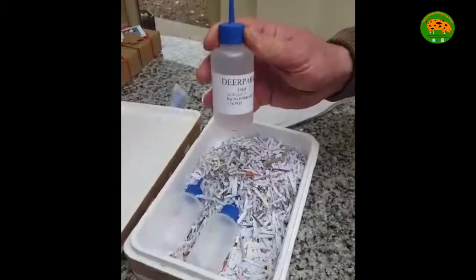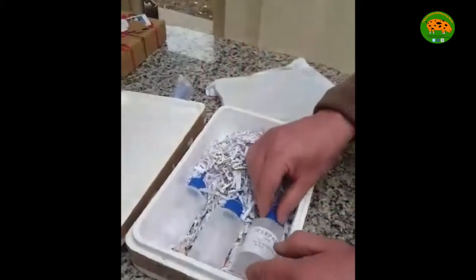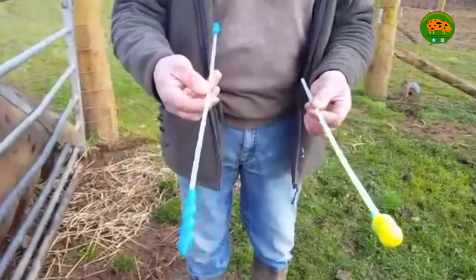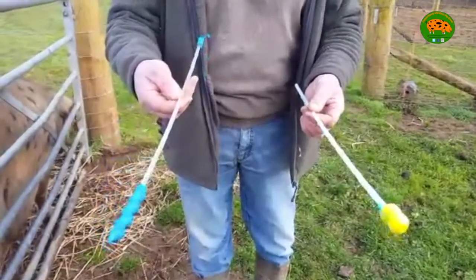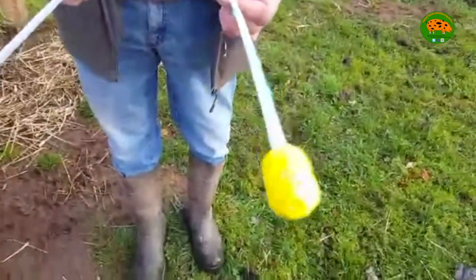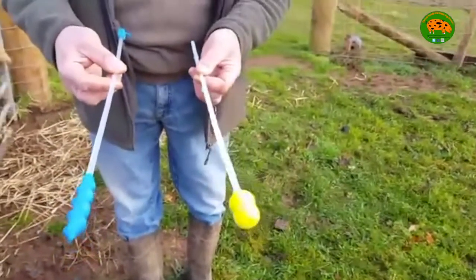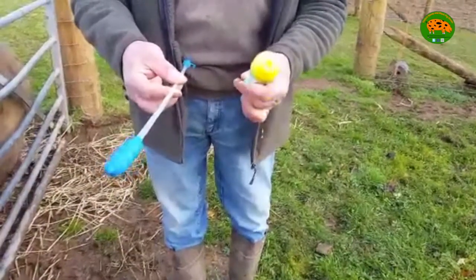Let's go outside and we'll meet the actors, Prue and Xander, and see what they're up to. This blue one is the one that comes with the semen from Deer Park, effectively mimicking the boar's penis with the sort of threaded end. You push in anti-clockwise and it'll stop about two or three inches out, or there's the sponge type. We've had success with both, so I'm not sure there's any benefits between the two, other than the yellow one looks a bit more comfortable for the sow.